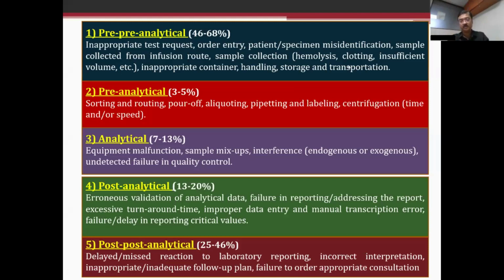3 ml of blood. But if you have taken more than that, then it may not be able to keep the blood unclotted. So part of the blood may clot, and the CBC result and others will become unreliable.